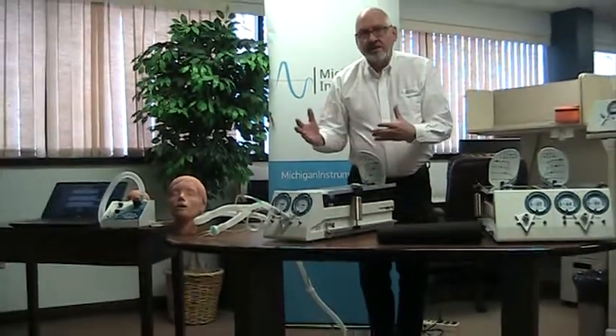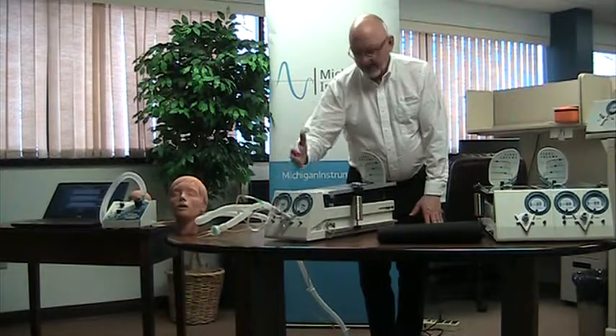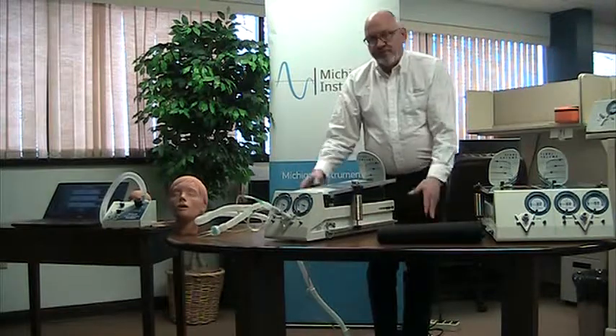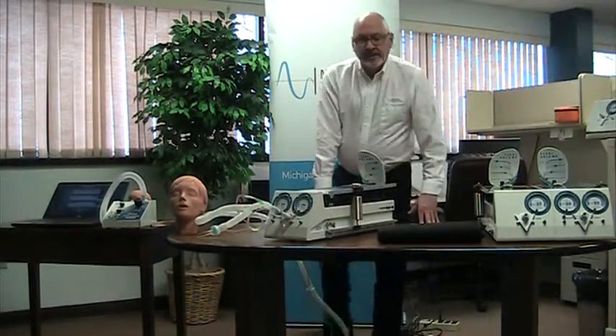So a lot of versatility in our lungs: variable compliance, variable resistance, measurement of tidal volume, measurement of pressures, and options for setting up a variety of connections and airway assemblies.